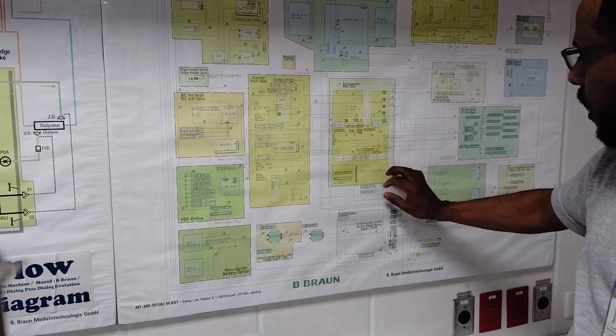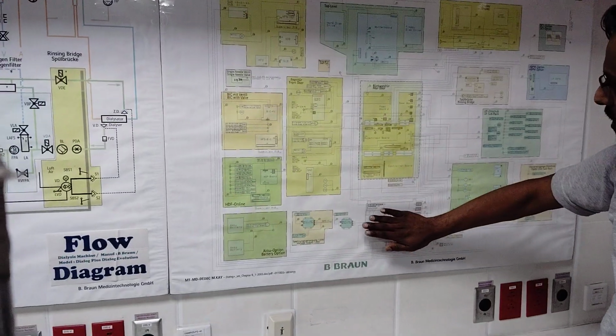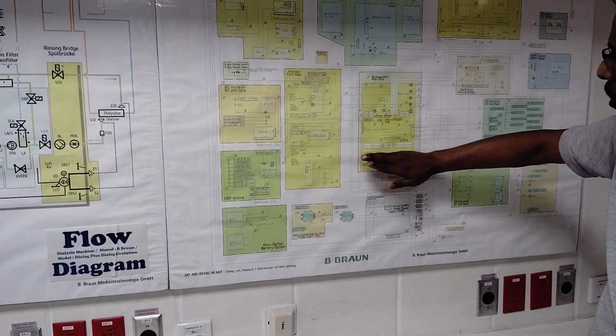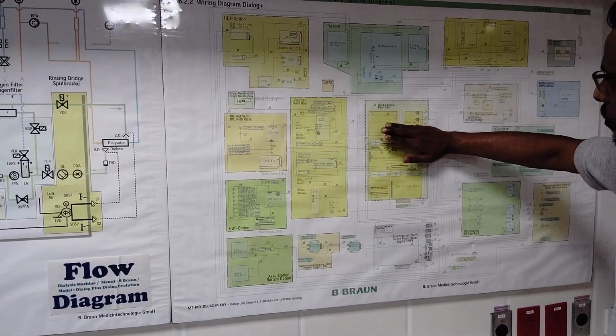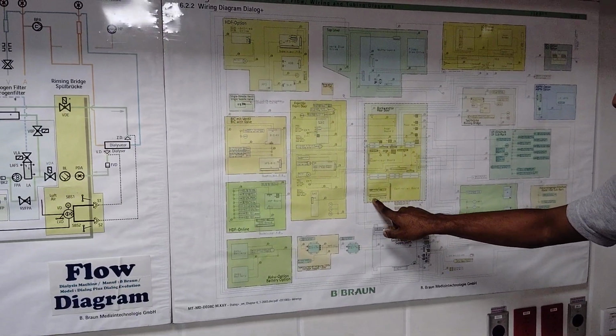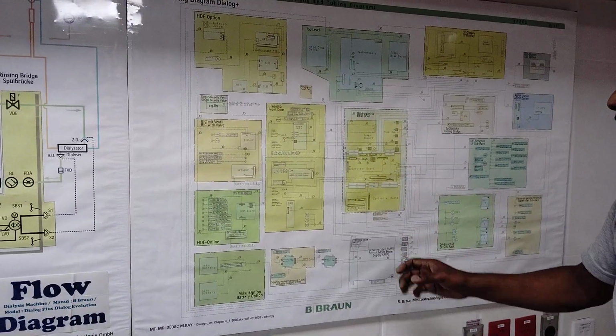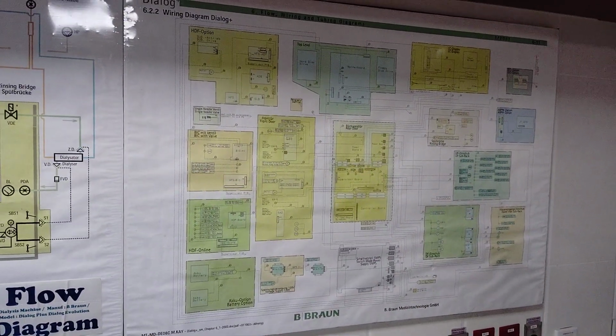The supervisor board and controller board, I will show you on the back side of the machine. These complete boards I will show you. One is the SMPS, one is a control board, one is a supervisor board, then power board 1 and power board 2. In between there are some small boards. You can see here the temperature board, and if it is an HDF machine, there are some HDF boards. I will show you the different ones in the machine itself later.